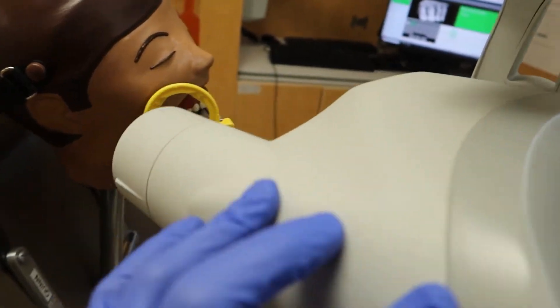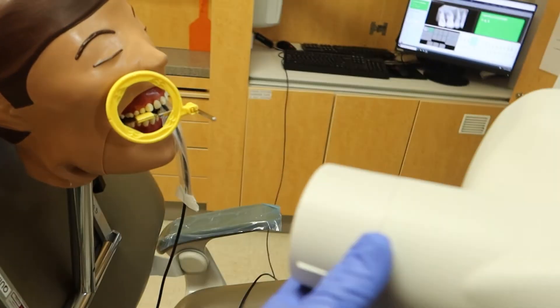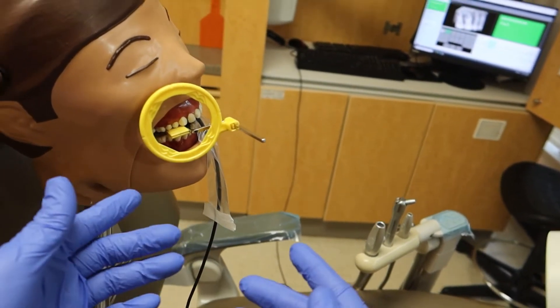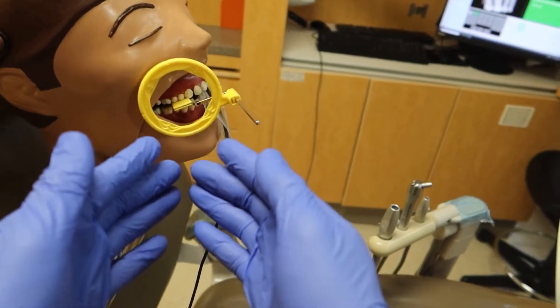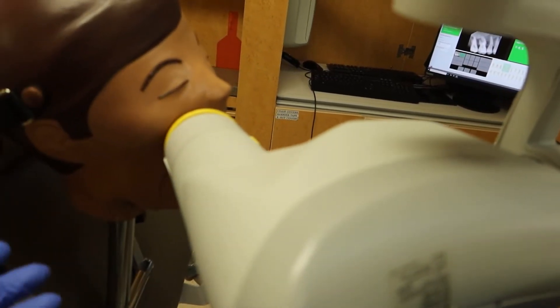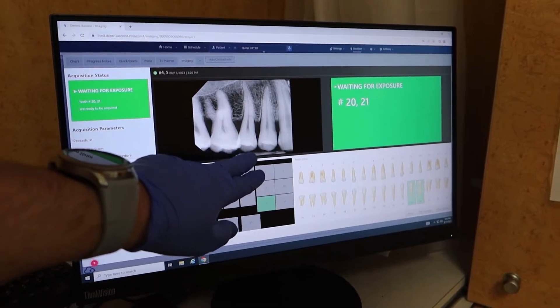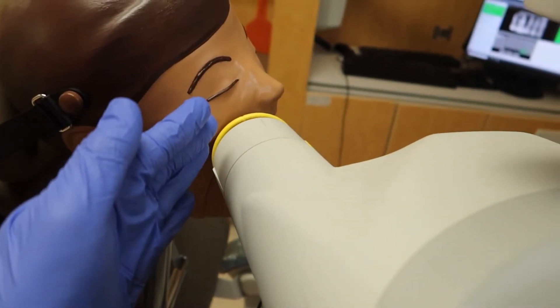From there it becomes easy — move the sensor out of the way, slide it forward a little bit, have the patient bite down, readjust, and get lined up. Now the issue is that sometimes the ring can lie to you. For the premolar shot, everything should line up and give a good result like before — but this one's not as pretty. I have the crowns in the frame, but I don't have that extra space above for the premolars.